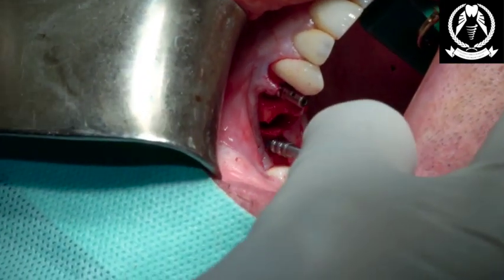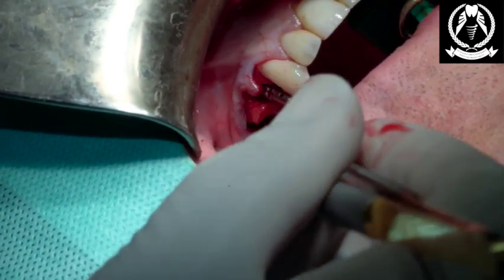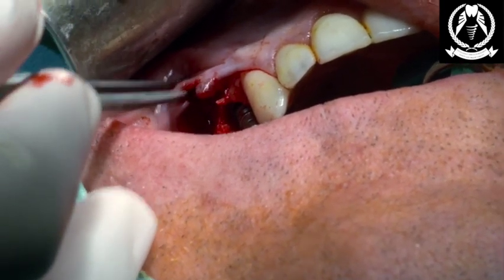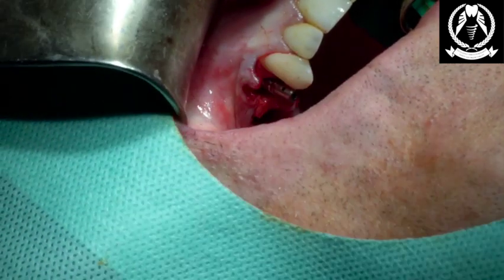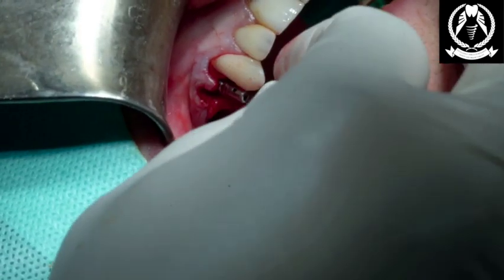So we're going to use a little bit of synthetic grafting. Sorry, just check our directions. And we're just going to build a little bit of bone in that region to build these areas up and support the implants in this area. So the girls are just mixing some synthetic bone material, and I'm quite happy with that. And open, Alan. Are you open already? You've got a little mouth, Alan.